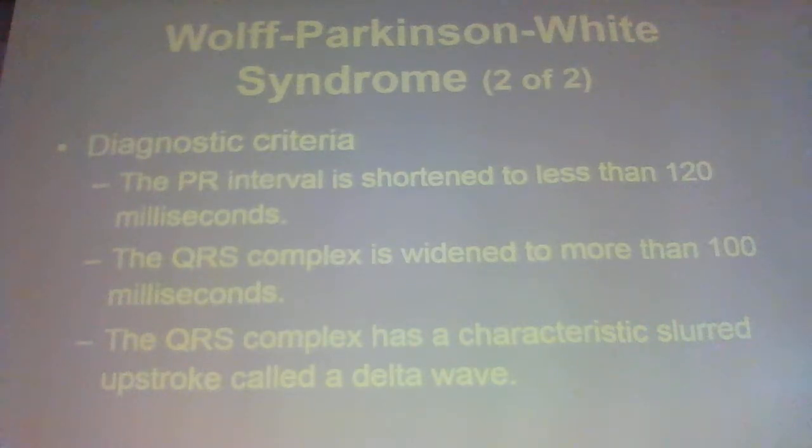Will you be able to see that pretty clearly even in SVT? So you just hope that they can pass that information on to you. Well, at one time, yeah, but usually you can see it pretty good, and your printout on the top will usually identify it for you too. Okay. Either say delta waves or suspect WPW or something. So that's your clue to look a little closer at it, you know?